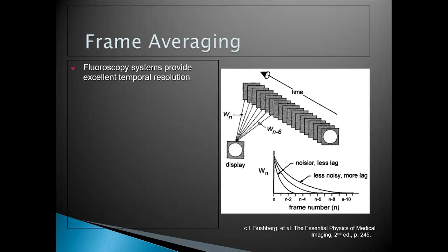Temporal resolution is the ability to depict objects distinctly, even as they traverse the tissue. You have blood flowing through a vessel.